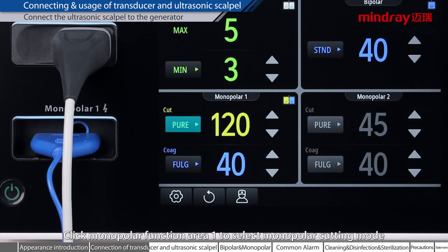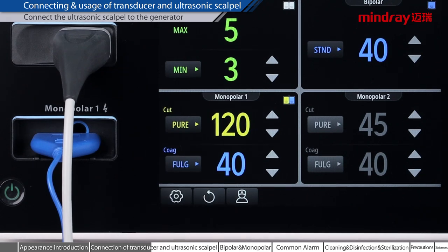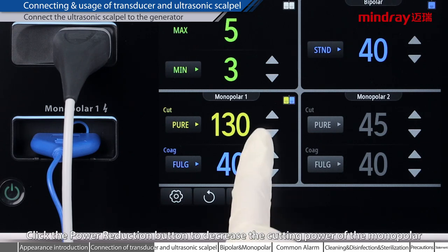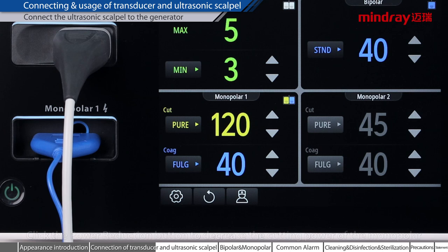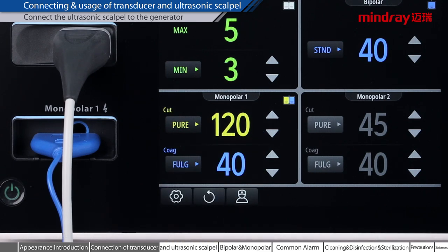Click monopolar function area 1 to select monopolar cutting mode. Click the power increase button to increase the cutting power of the monopolar. Click the power reduction button to decrease the cutting power of the monopolar. Click monopolar function area 1 to select monopolar coagulation mode. Clicking the power increase button increases the monopolar coagulation power. The monopolar coagulation power can be reduced by clicking the power reduction button.